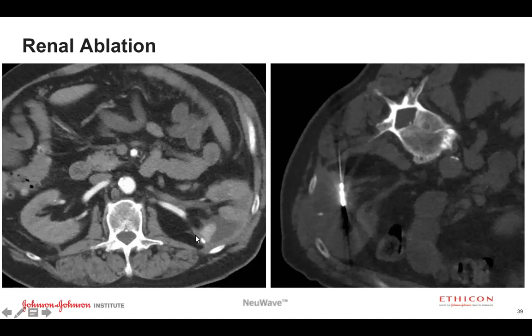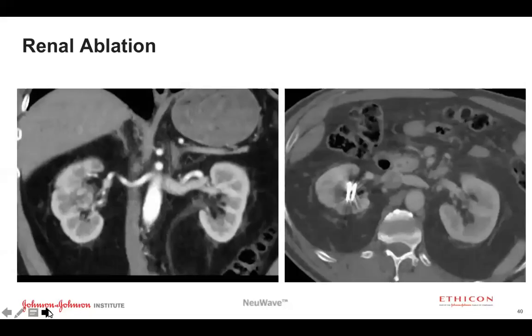If there's a long axis to the lesion, then I try to plan my ablation so that I'm going along that long axis. Here the collecting system was nowhere close, so that wasn't a factor. Not a lot of hydrodissection was involved here because the kidney was already plastered against the body wall from their prior surgeries. So this was a relatively straightforward case for microwave ablation with a very nice outcome.